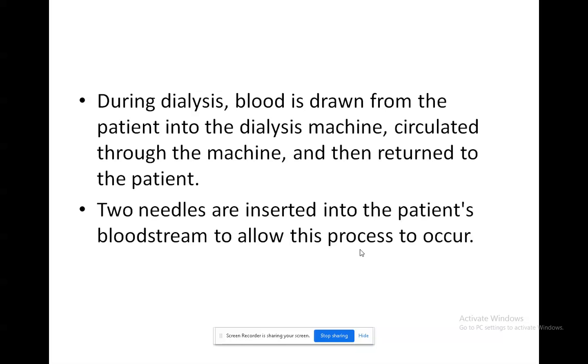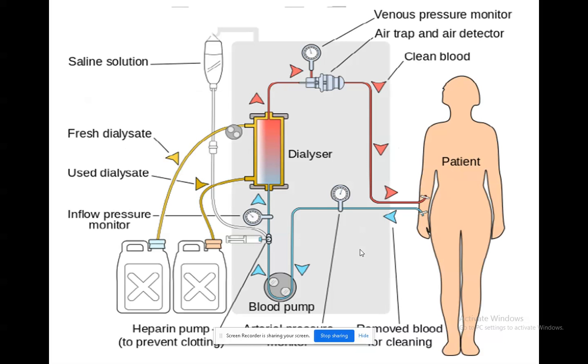So here you need two needles to insert into the patient's bloodstream. One needle is used for taking the blood from the human body and another needle is used for returning the blood back to the patient. So here two needles will be required for the process.